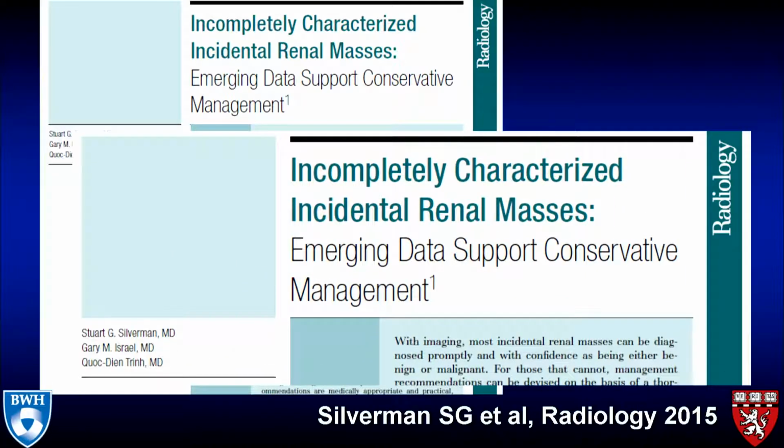So back in 2015, we said, well, this idea that we've got to do a renal mass protocol CT and MRI in everybody, it's probably not the right way to go. And in fact, the most common way renal masses present today is for a mass that's performed on an exam and which is really not completely characterized, okay?